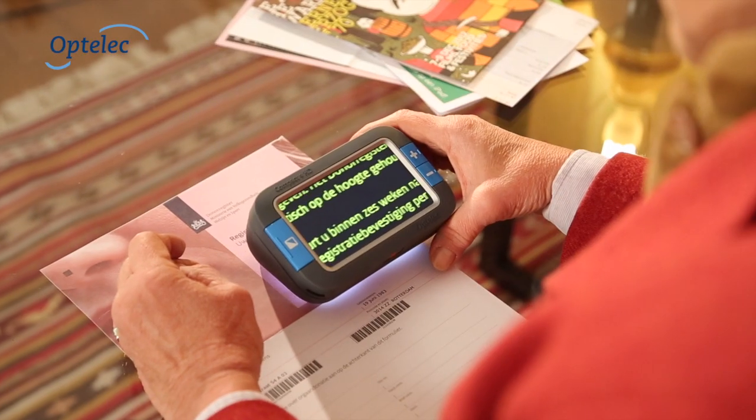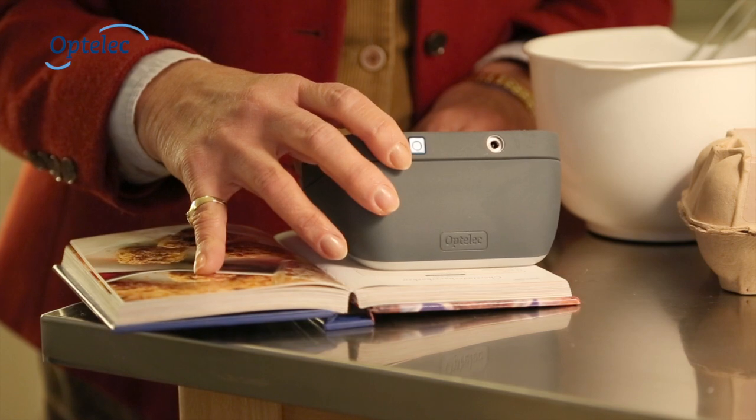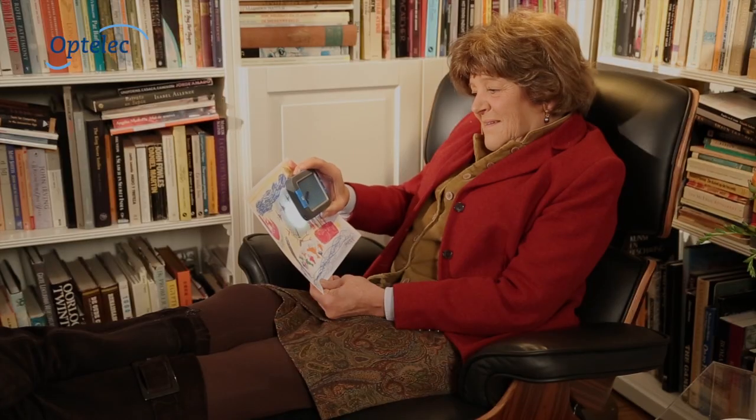The Compact 4HD can help you read your letters, review your prescriptions, and see your grandchildren's drawings.